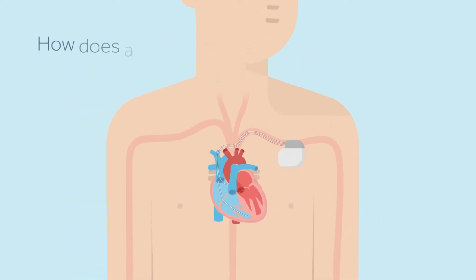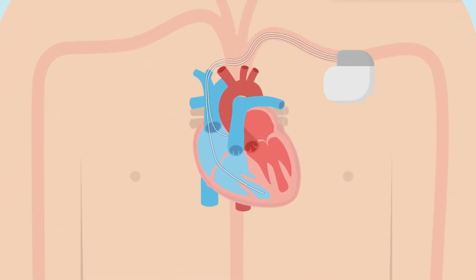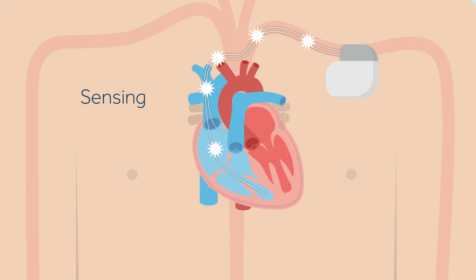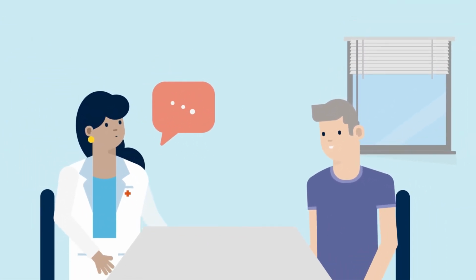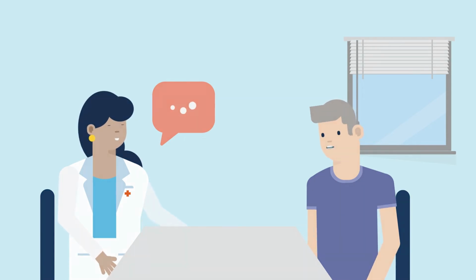to your pacemaker. A pacemaker is designed to mimic the heart's natural rhythm with 2 main purposes: pacing and sensing. A pacemaker will send an electrical impulse to the heart when the heart's own rhythm is too slow or is interrupted. This electrical impulse starts a heartbeat. A pacemaker will also sense or monitor the heart's natural electrical activity. When the pacemaker senses a natural heartbeat, it will not deliver a pacing pulse. Your doctor will help determine if you need 1 or 2 leads to treat your condition and will program your pacemaker to deliver the most effective therapies for your specific heart condition.